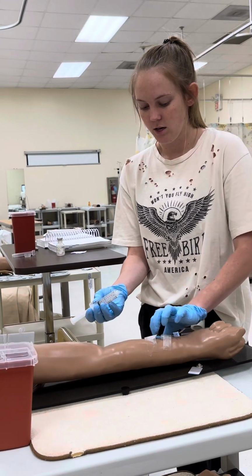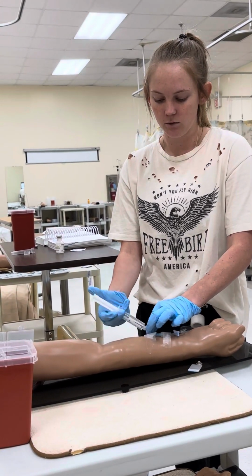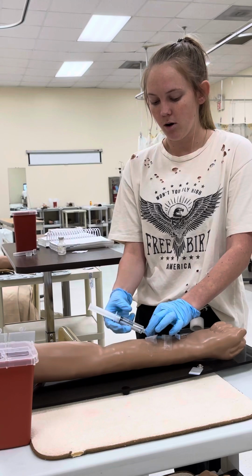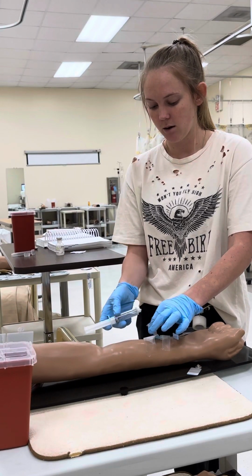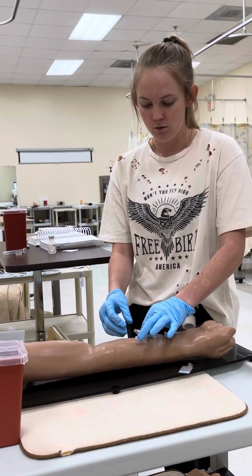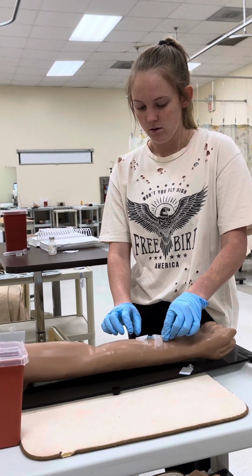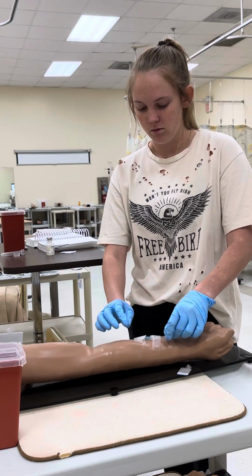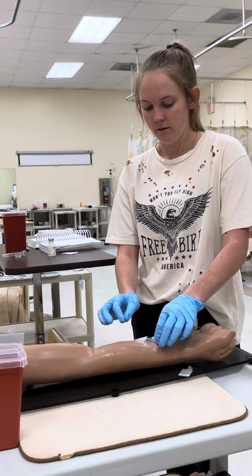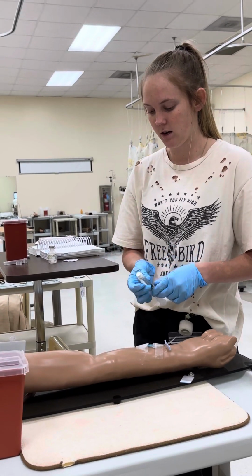flush the line again using the push-pause technique to flush it after as well, in case there's any medication left in the tube. So then I will push and pause, and I will do that over a 1 to 2 minute time period as well. I'm then going to recap the INT and clamp our tube. I will then adjust the flow rate of the infusion if necessary, but again, our patient is not having an infusion.